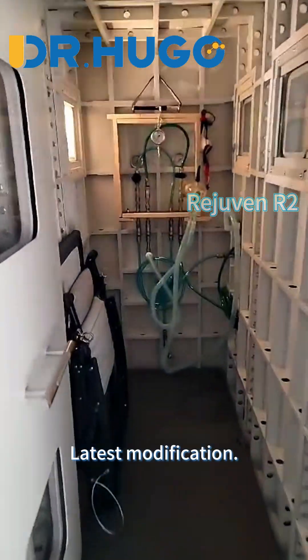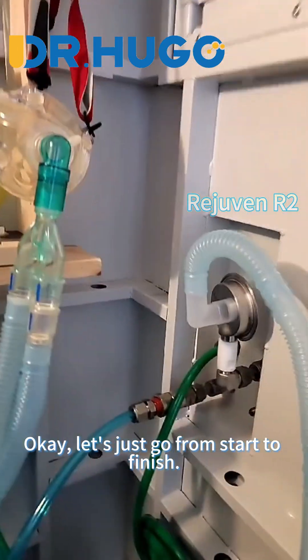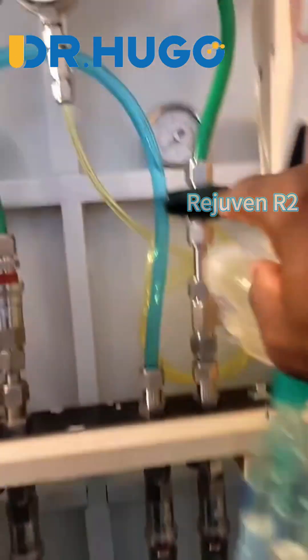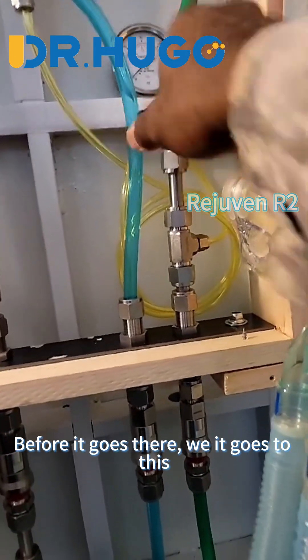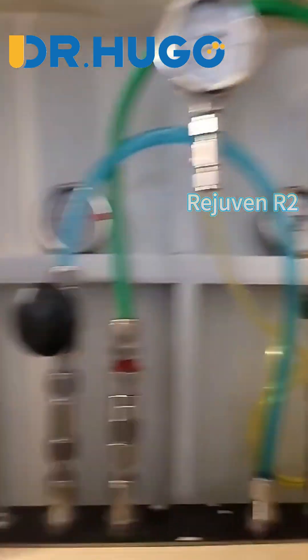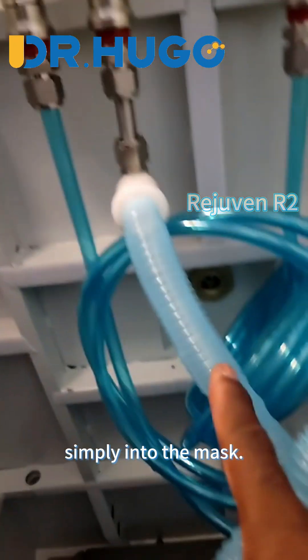Latest modification: updated the control panel — more simple. Let's go from start to finish. Oxygen comes in from the interface, wraps around, comes up green. Just simply on and off. Before it goes there, it goes to this gauge for the oxygen pressure. Then it comes around simply into the mask.